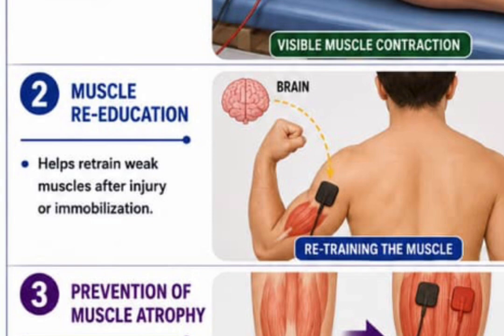So the patient is having what? Paresis, which means there's muscle weakness, maybe post surgery, maybe post any issue. It could be any pathology that is wrong with the muscle. It could help with muscle weakness after injury or immobilization. So you are just recruiting motor fibers. It's not that the muscle is already active, but you just need more intensity to make it start contracting. Are you getting that?